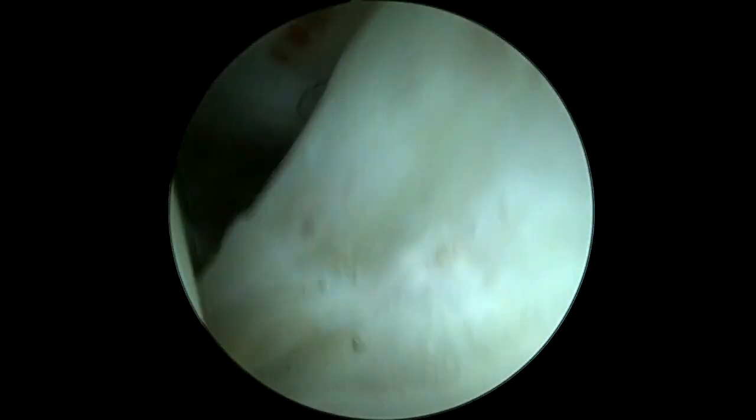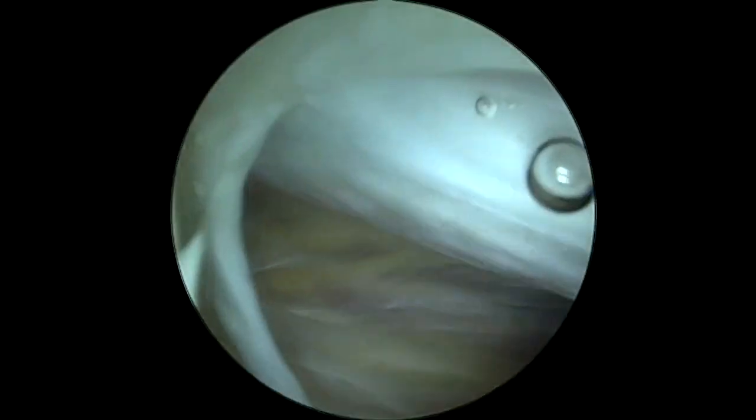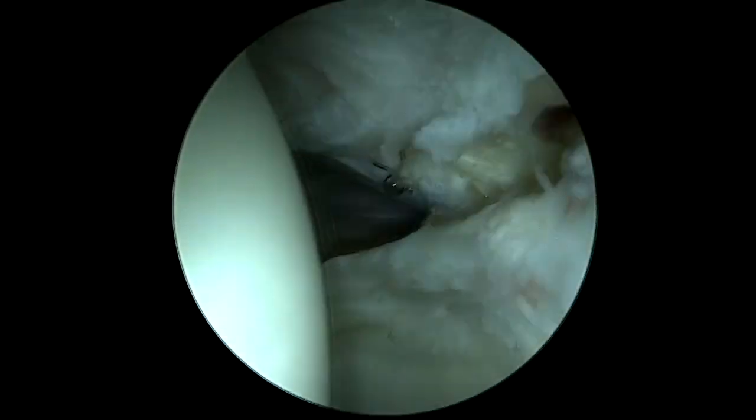The iliopsoas tendon is often visualized through the medial capsular defect, and it is possible to drive the camera into this defect to visualize the entire distal tendon. Capsular adhesions are often present.